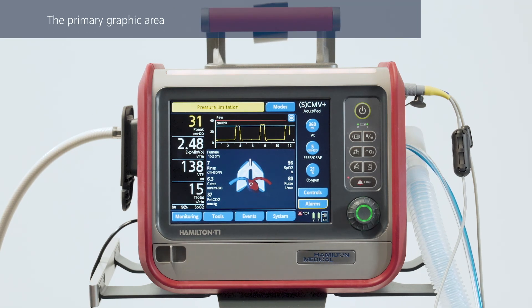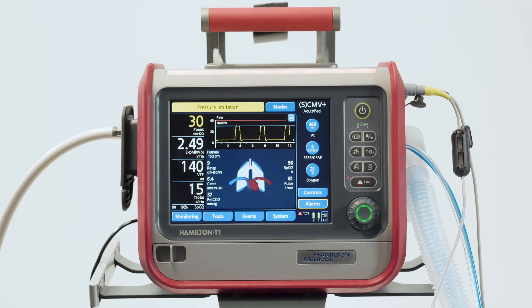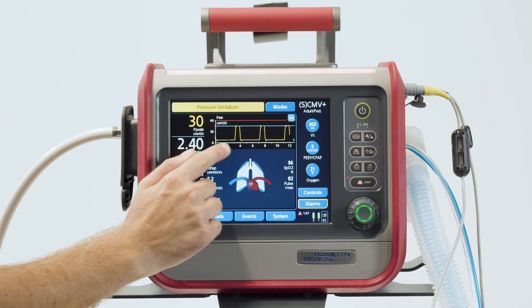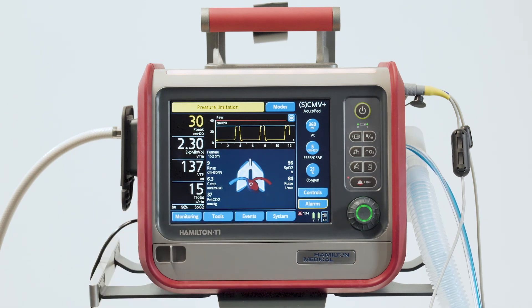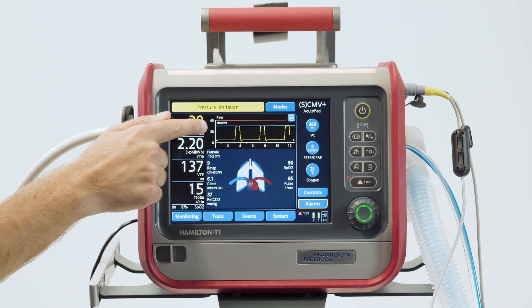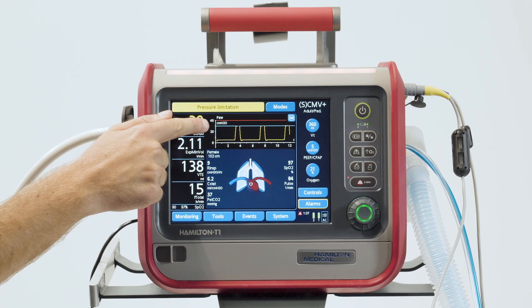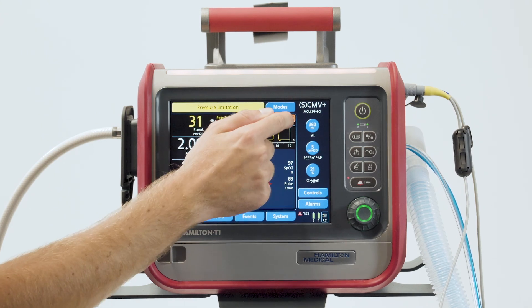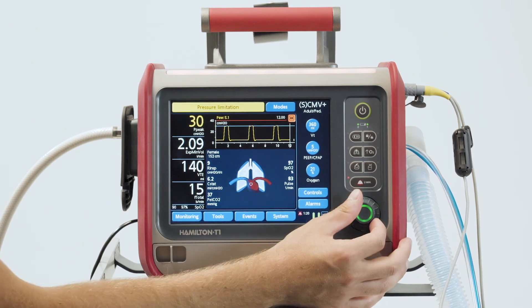The pressure-time waveform is always shown, which means you can't configure this area of the main display. This waveform plots pressure against time and also shows some additional information. The red line represents the pressure alarm limit, while the blue one corresponds to the maximum safe pressure we can apply. This is always 10 cm of water below the set high pressure alarm limit. If needed, you can freeze the graphic and scroll through the points to look at them more closely.